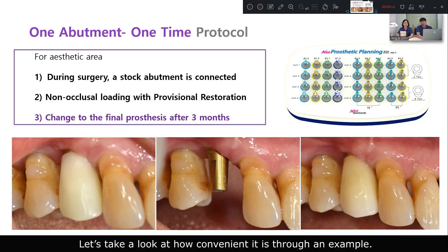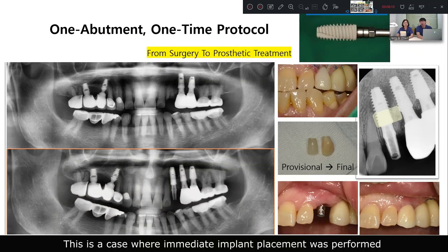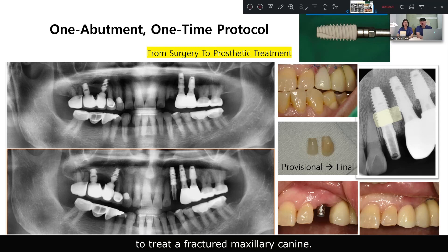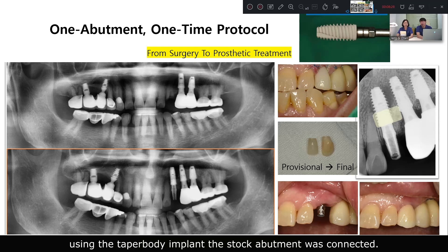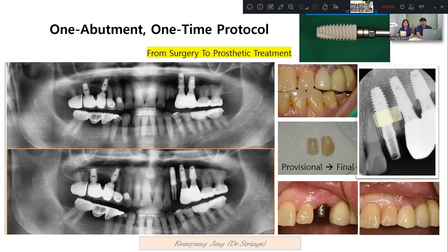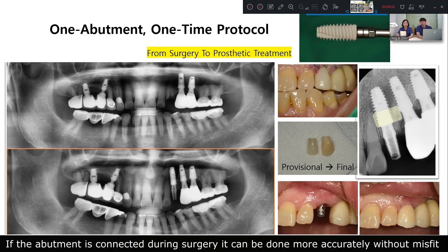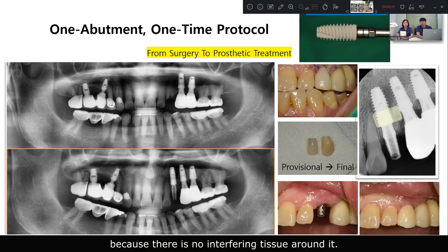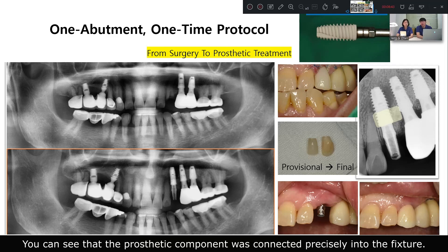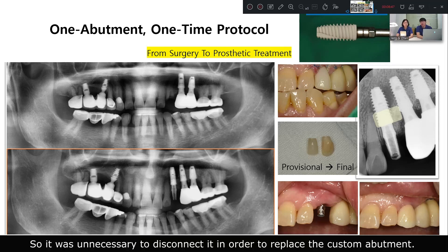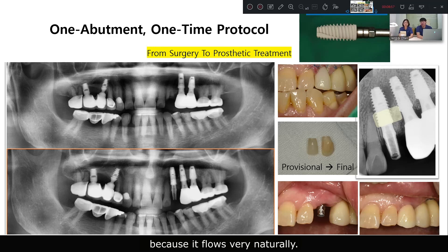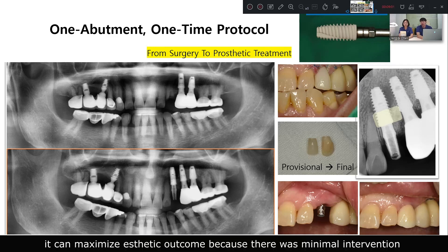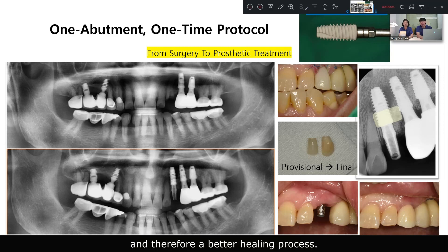Let's take a look at a clinical example. This is a case where immediate implant placement was performed to treat a fractured canine. After obtaining good initial stability using the stable-body implant, the stock abutment was connected. If the abutment is connected during surgery, it can be done more accurately because there is no interfering tissue around it. You can see that the prosthetic component was connected precisely into the fixture, so it was unnecessary to disconnect it to replace with a custom abutment. I love this workflow, especially for maxillary incisors or canines, because it flows very naturally and can maximize aesthetic outcomes with minimal intervention and a better healing process.